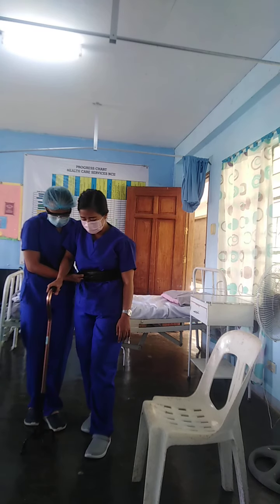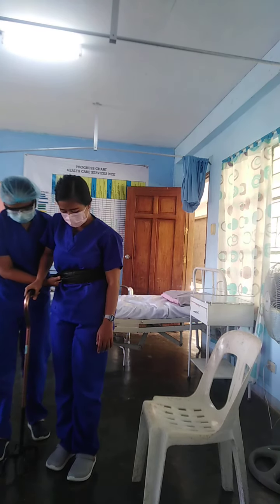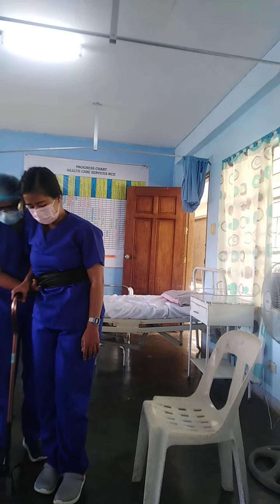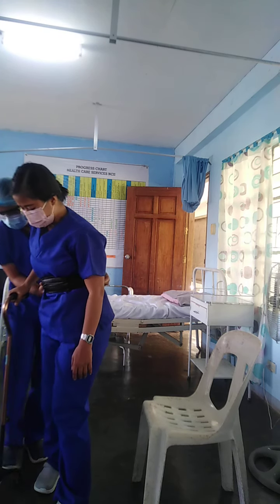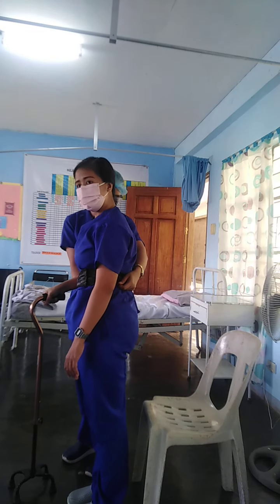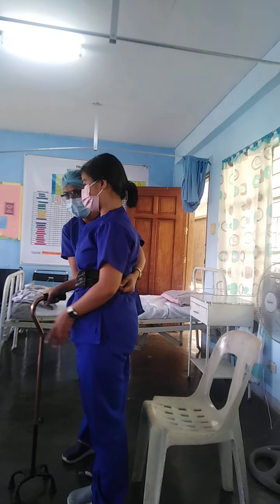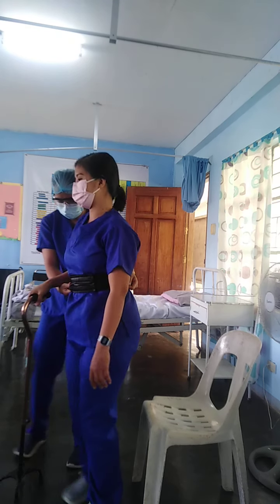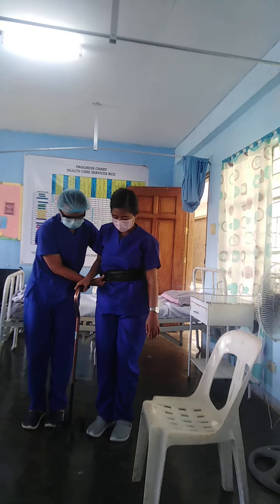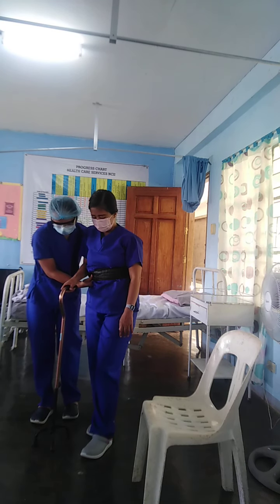Kaya-kaya nyo na po. Then, ilipat po tayo para po maka-upo, ma'am. Ganun din po. Then, pang-upo tayo. You need to transfer in front of your patient. Then, sige po, ma'am. Maglakad po tayo.